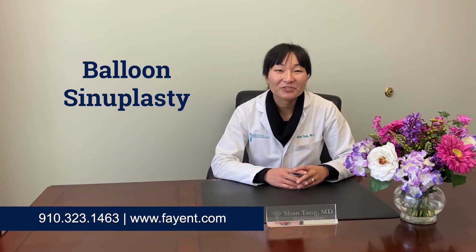When your sinuses are diseased, the passageways that connect them to your nose are closed off, and balloon sinuplasty is a way we can use to open them back up. When you have the procedure in the office, your nose is first numbed up very well using only topical gels, and then we place the apparatus in your nose under guidance of cameras as well as a CT guidance system, which shows us where the catheter tip is in real time.